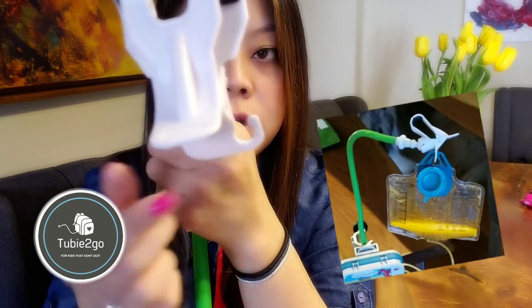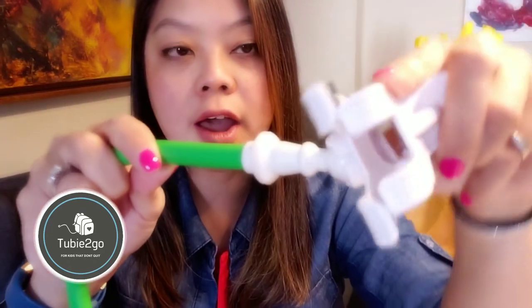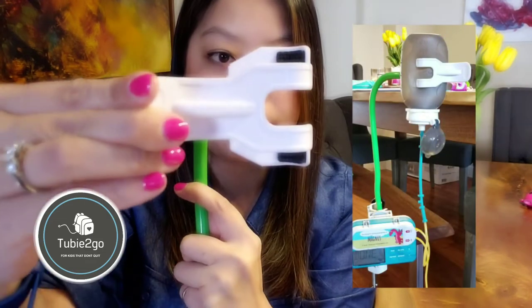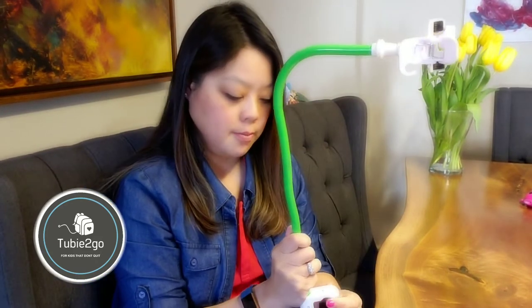Last, there's a holder up top which has a built-in upside-down hook for hanging a feed bag — whether it's Kangaroo or Infinity. There's also a notch inside the top of the Free Arm where you can hang things as well. I've also discovered that you can actually clamp a squeezy bottle in here with no problem and pump. I was worried about whether the squeezy bottle would stay clamped as it empties and collapses, but it totally does.